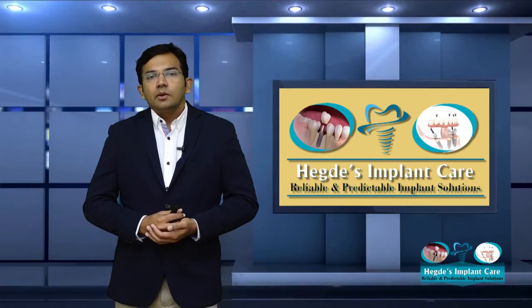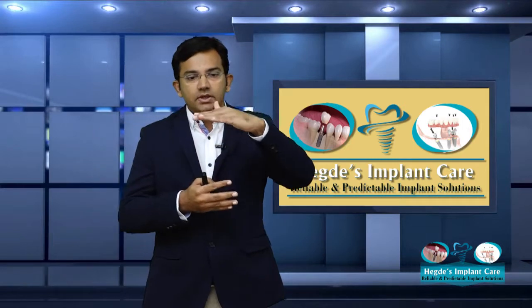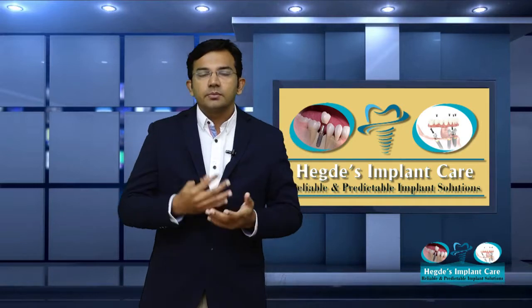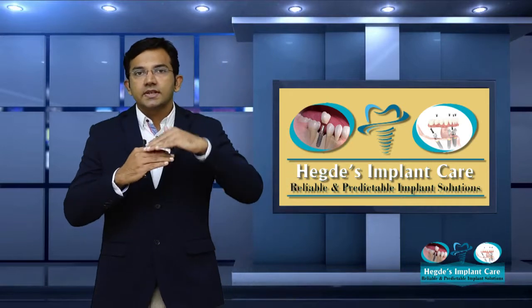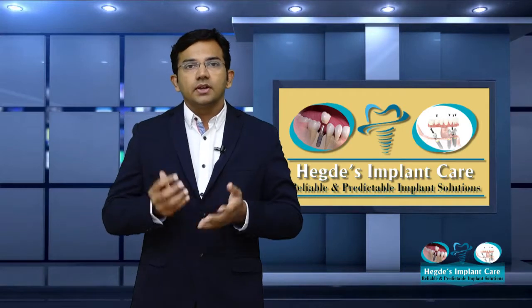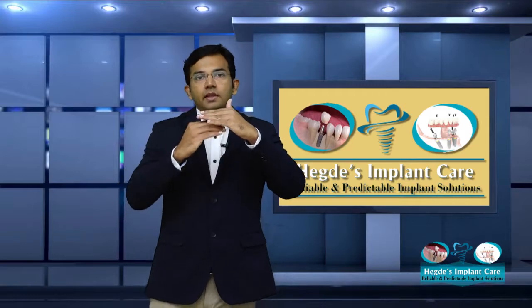Generally, we can either augment bone on top of the ridge, which means this is the ridge, and this is the teeth area, so above the ridge we can augment bone. There are some techniques for bone augmentation. The other technique is on the sinus side of the implant, where we can augment bone. So both places you can augment bone. Today I am going to talk about maxillary sinus augmentation, so that we can add a little bone and then place the implant.